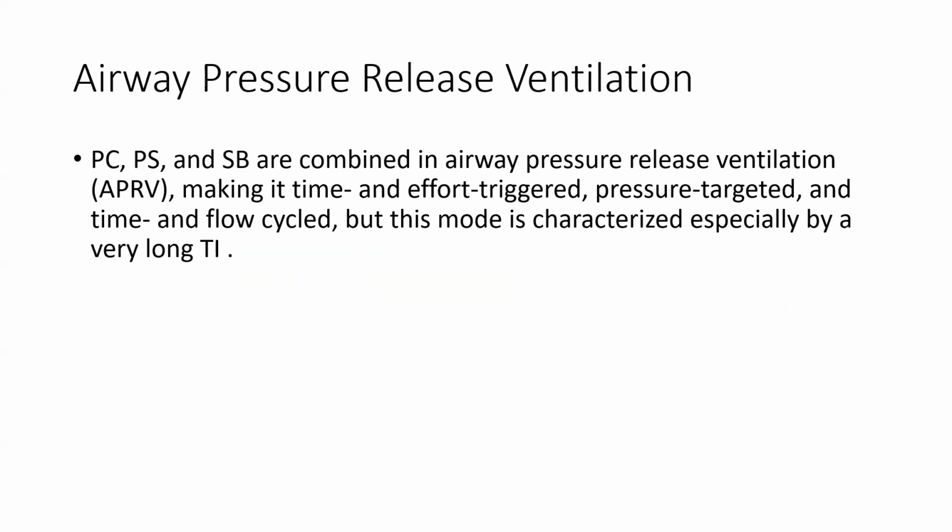Now, airway pressure release ventilation. Pressure control, pressure support, and spontaneous breaths are combined in airway pressure release ventilation, making it time and effort triggered, pressure targeted, time and flow cycled. But this mode is characterized especially by the very long inspiratory time.